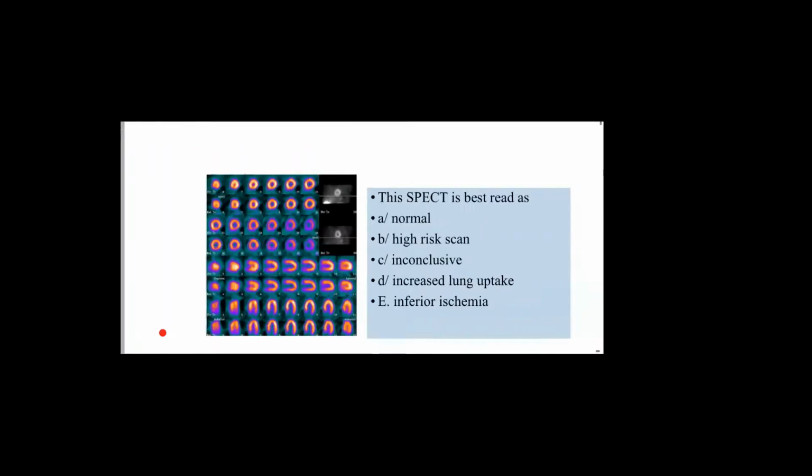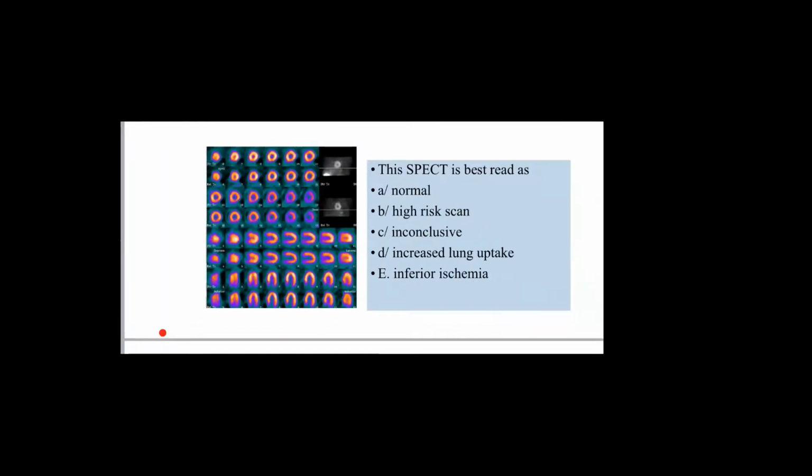Now, what is this? This is a question. The SPECT is best read as: normal, high-risk scan, inconclusive, increased lung uptake, or inferior ischemia. So you can zoom in and see. What do you think? Looks normal. Exactly. This is so normal.